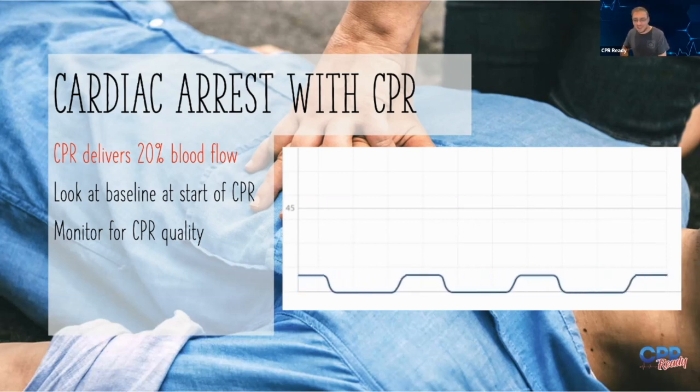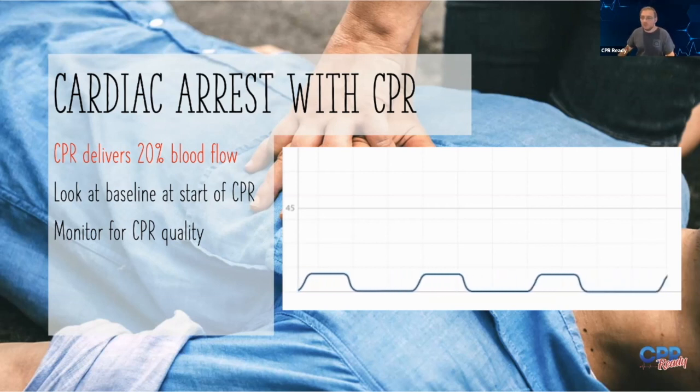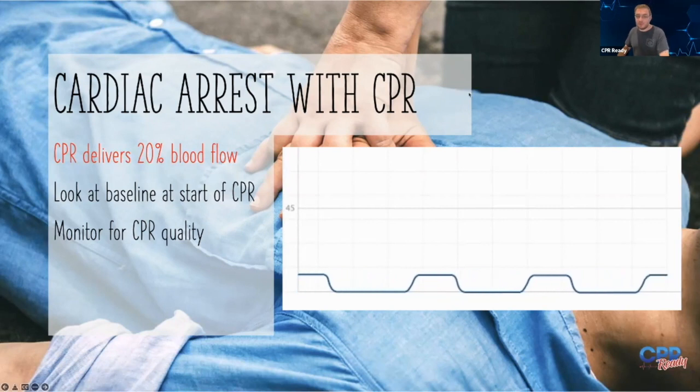a CPR class. Even on kids, when we feel like we can go forever because they're smaller, they require less effort, even those little imperceptible reductions in compression quality will further reduce that cardiac output. And then we're not perfusing as well, hence not producing as much CO2. And then we're getting those low numbers.